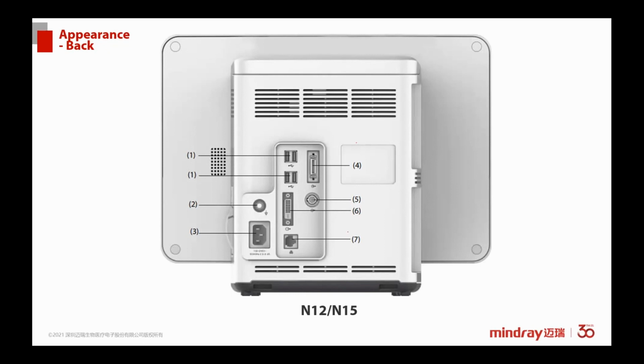Number 7 is the network connector. The function here is we also have 2 different functions. The first one is to connect it to our CMS central monitoring station. The second one is that we can use the network cable also for the software upgrade.